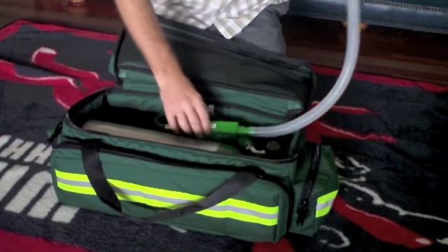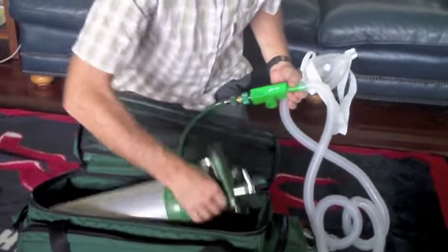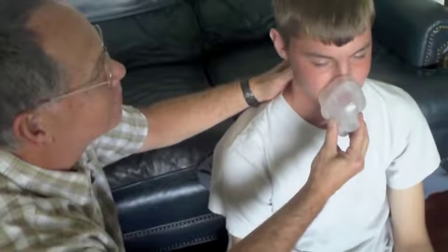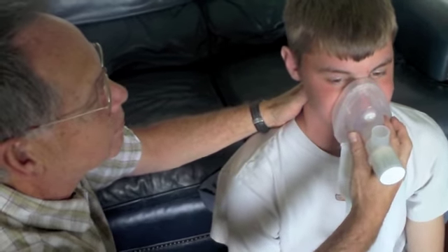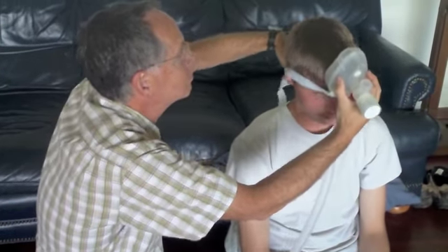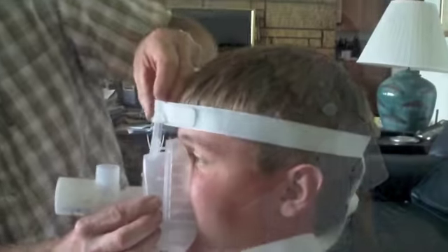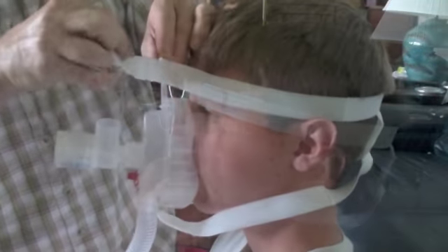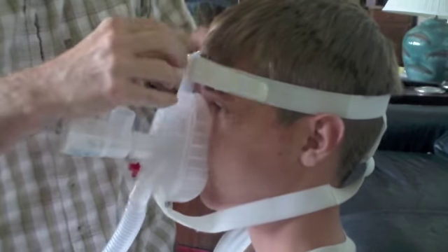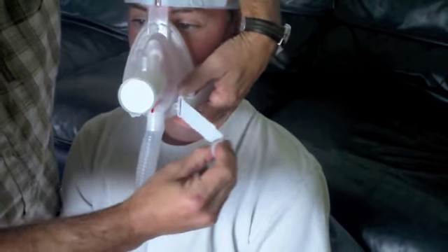Normally, the CPAP will come pre-assembled in the bag. After educating the patient, select the correct mask size. Place the mask on the patient. Secure the mask to the patient with the straps provided. Tighten the straps securely so that there is a good seal.